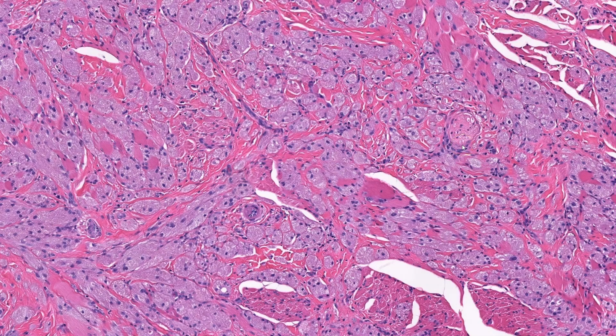Speaking of which, although the vast majority of granular cell tumors are benign, atypical and malignant cases can occur. Atypical features should be diffusely present and include nuclear pleomorphism, prominent nucleoli, high nuclear to cytoplasmic ratio, spindle cell morphology, a mitotic rate greater than 2 per 10 high power fields, and necrosis.